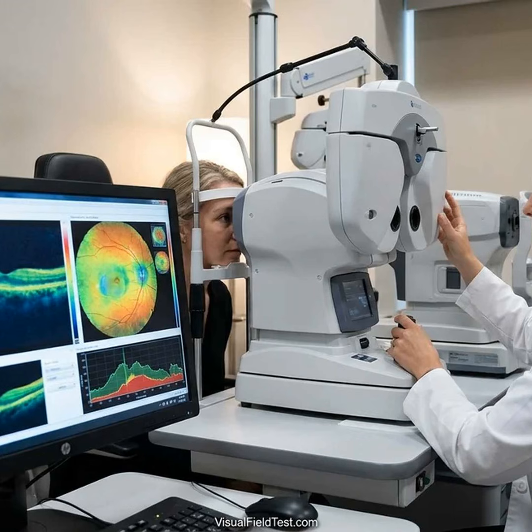For example, an analysis found that OCT flagged new thinning in about 63% of mild glaucoma eyes versus 39% by visual field. In practice, this means if your ophthalmologist sees gradual RNFL thinning on your scans, they will often treat that as true change, even if your field test hasn't clearly worsened yet. This approach is supported by research showing that thinning on OCT currently predicts quicker future field loss. In other words, a small drop in RNFL or ganglion cell thickness is taken seriously because waiting for a field defect might come too late.